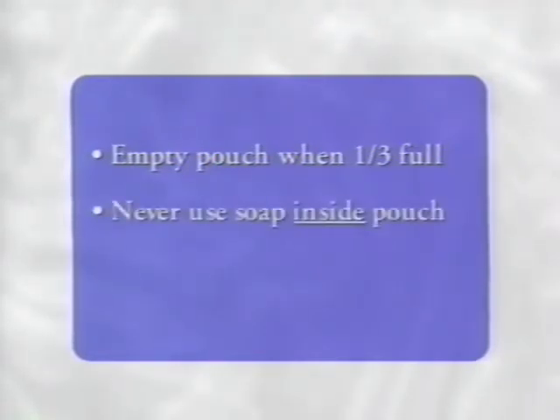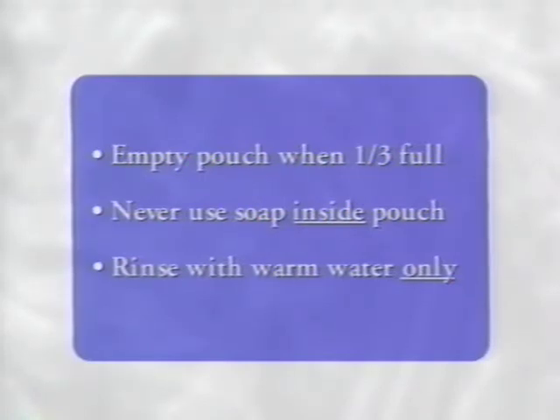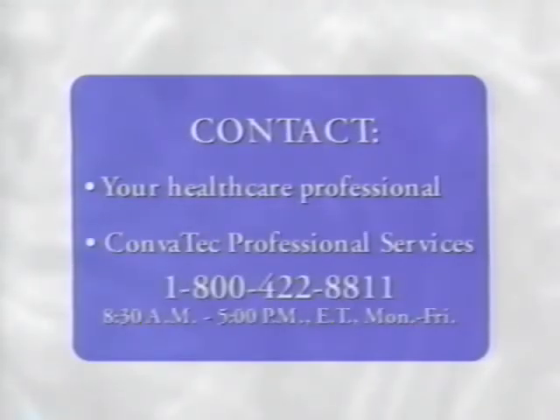Remember to empty the pouch when it is 1/3 full. Never use soap or even mild cleansing agents inside the pouch. You can rinse it out, however, using lukewarm water. If you need more assistance, please contact your healthcare professional or call Convatec Professional Services at 1-800-422-8811.